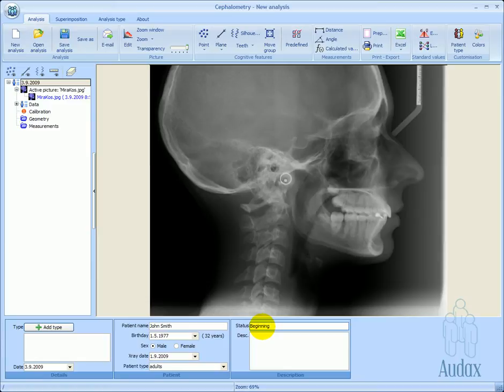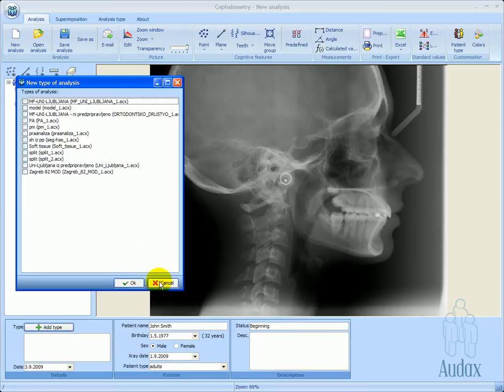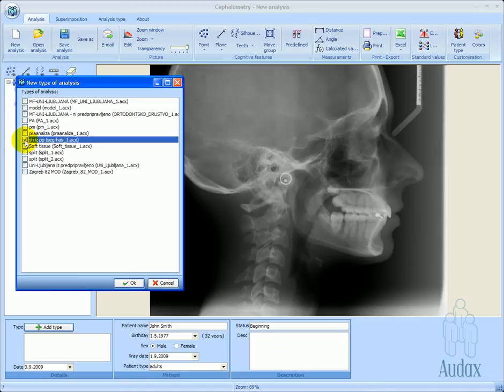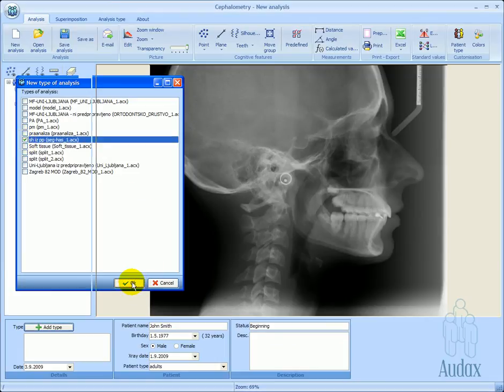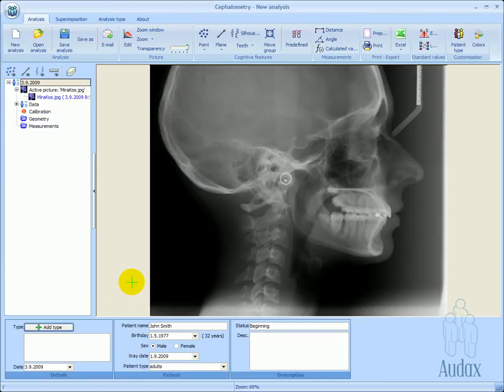The patient's treatment status is beginning. In the next step, we choose the analysis type. Let's select one from the list.